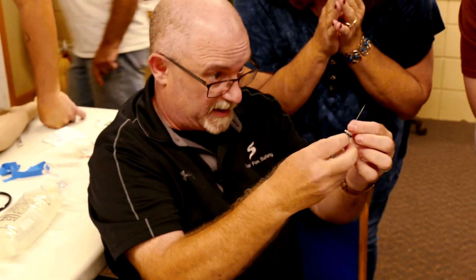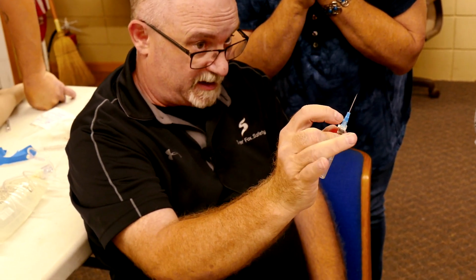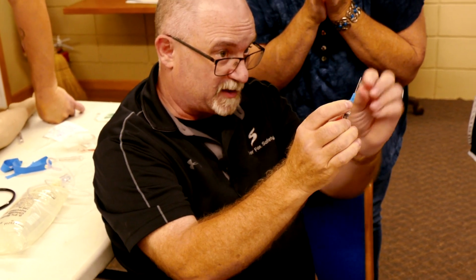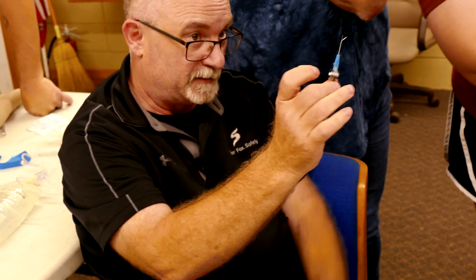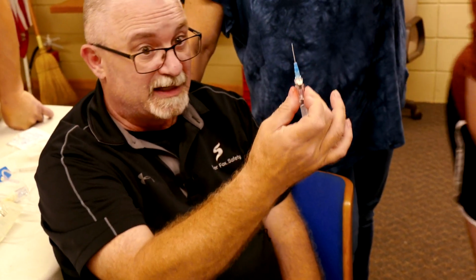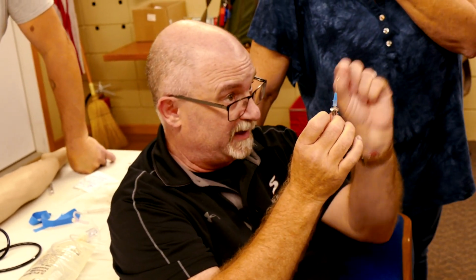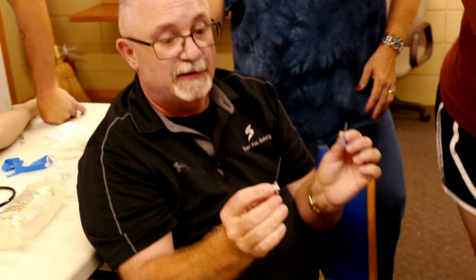All right, let's get this back to where it should be. So these two are holding solid. This one holds back. But if you're punching around, see what happened? It already came off the top. So I'll take the extreme of that, and now we try and pull it back on. And then there's plastic in there. That's catheter shear. I really don't want that floating around in my patient, and that's a real exaggerated example. But even a little piece can be dangerous.